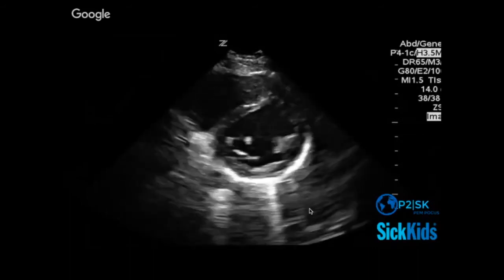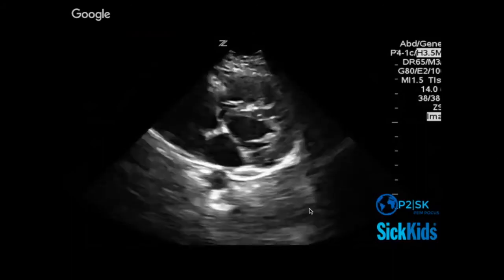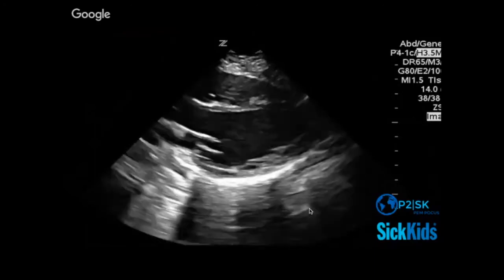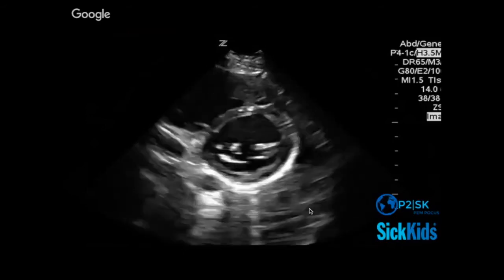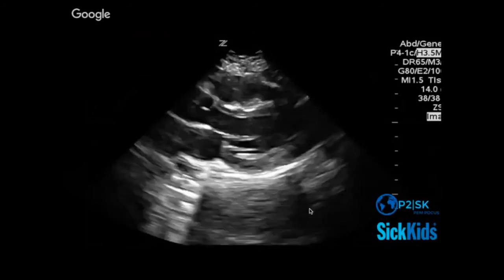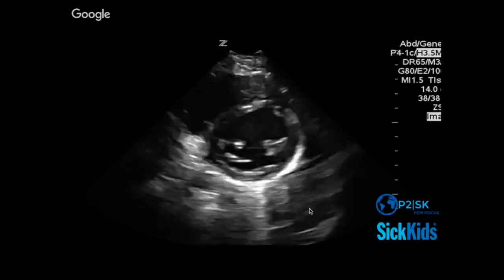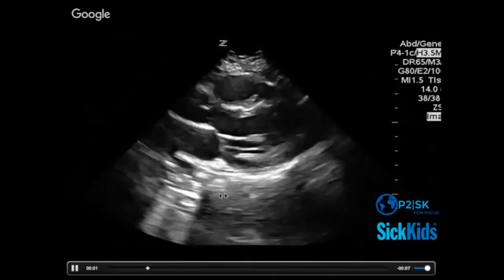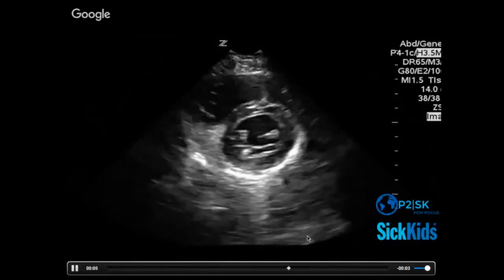Yeah, nice little clip there. This is our ex-fellow Jade Seguin, who is doing a kind of beautiful, hey, I've got 6 seconds of video and I can show you 2 views in that time, which is nice. So she's switching between a parasternal long and a parasternal short. What does the function seem to you? Okay, and then, yeah, there are some B lines arising from the pleural surface that abuts the heart.